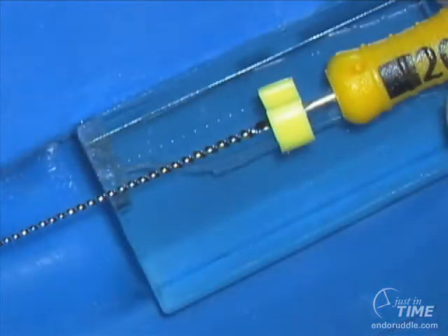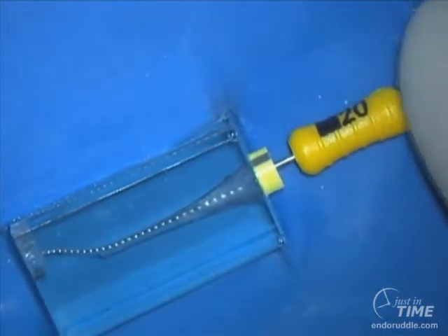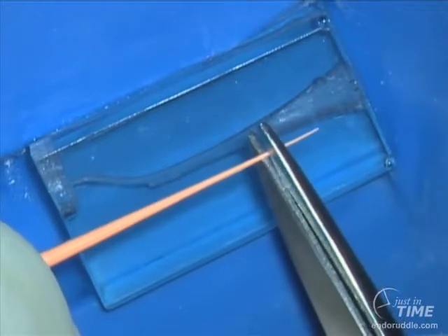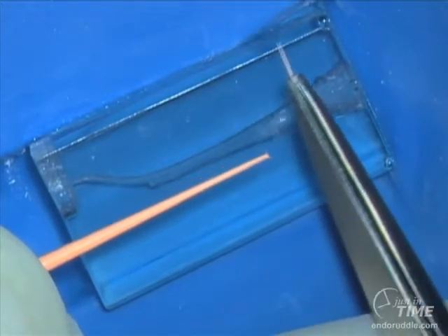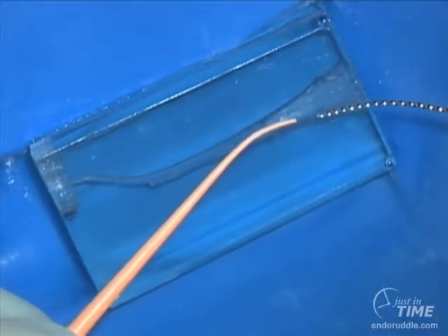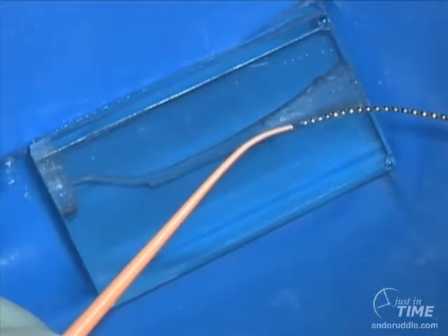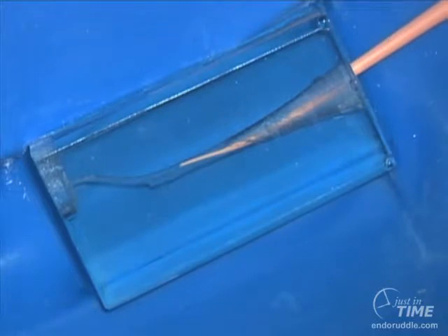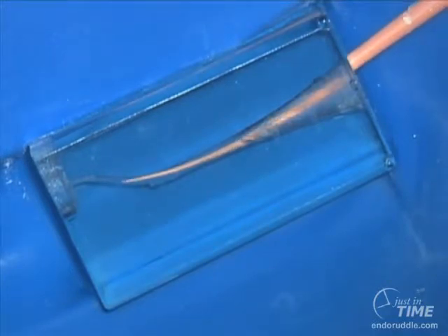So in some instances, if in fact we can confirm that the foramen is 0.2 of a millimeter, then we can trim a cone to 0.2 of a millimeter. You can use scissors or a gutta gauge, or you can compare the apical part of the cone to the file that was snug at length, and you can take this cone and pre-curve it and slide it through to length.